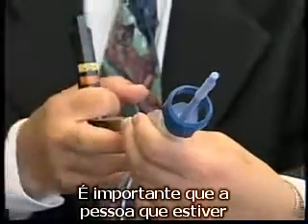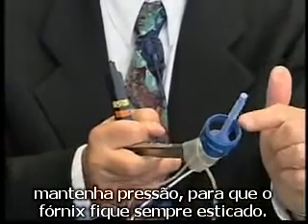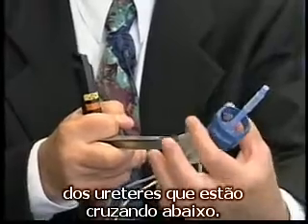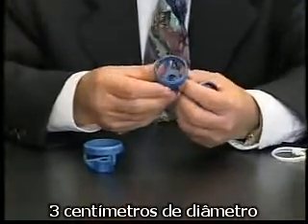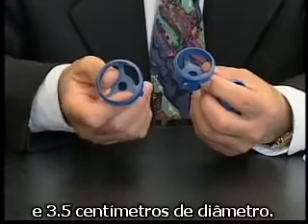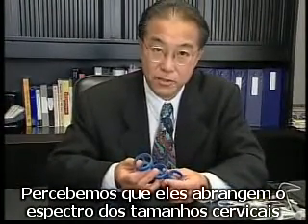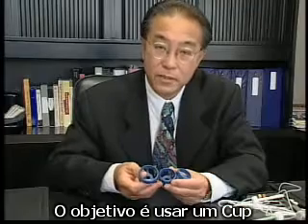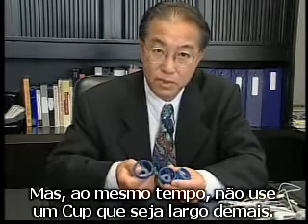It is important that the person applying the manipulator during the surgery maintains pressure so that the fornix is always on stretch, and this has the effect of distancing this area from the ureters below. Three cup sizes are available: the 2.5 cm diameter, 3 cm diameter, and 3.5 cm diameter. We have found that this very much covers the spectrum of cervical sizes that we encounter for total laparoscopic hysterectomy.